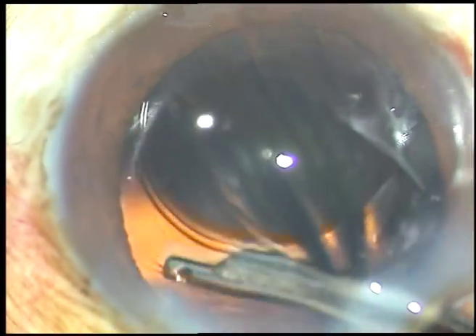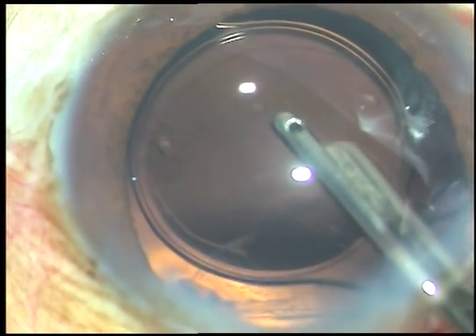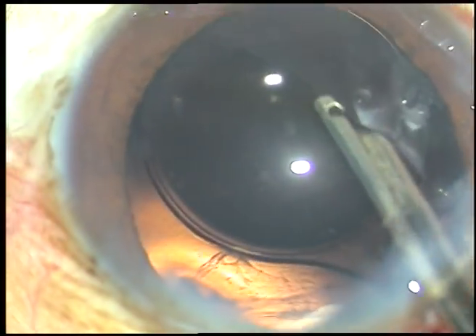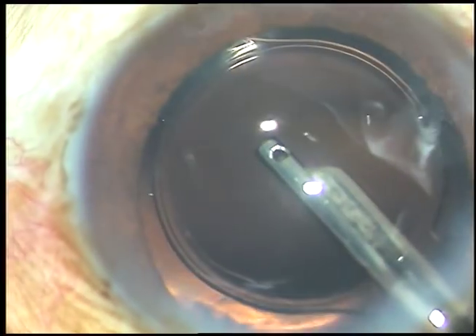But here I notice one thing. There is a tag — a thread-like tag from 2 o'clock. I thought it is lens fiber, but it is not. It is vitreous strands.